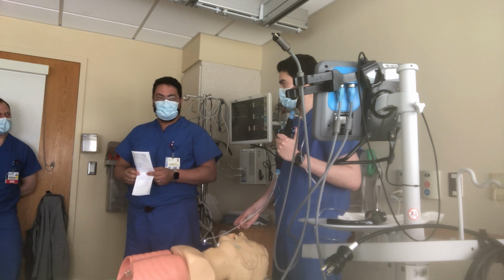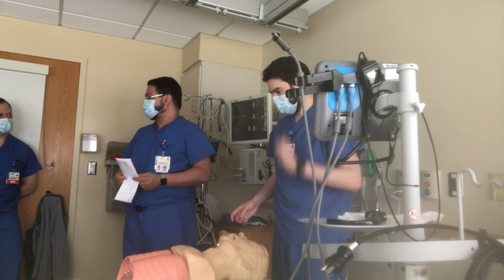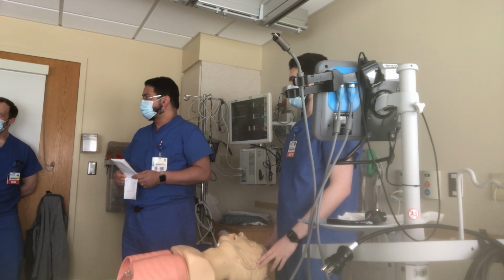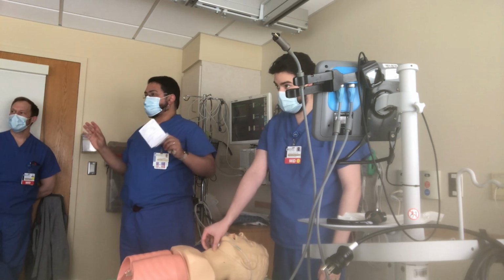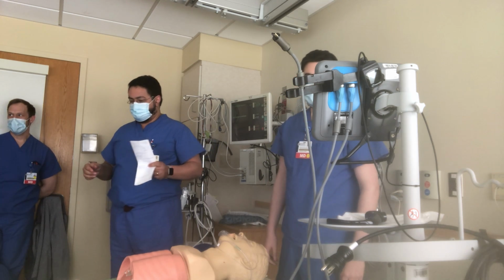So he is, as we know, a difficult intubation. That's why we were preparing the fiber optic intubation. So that's going to be a struggle. Okay, so his oral airway is compromised. Is this something to do with a surgical airway? Correct. Exactly. Surgical airway. There's no way. Is that when you crack them? Yes, that's when you crack them. You should say that in a loud voice, madam. Sorry, I wasn't sure.